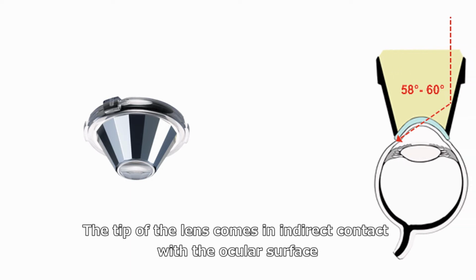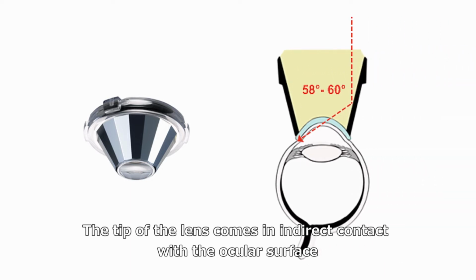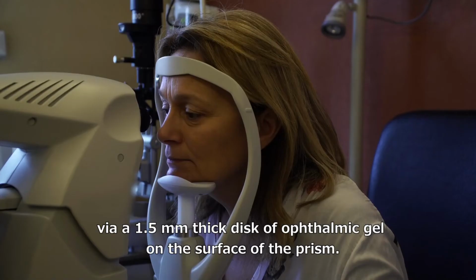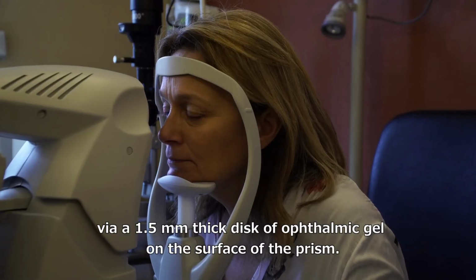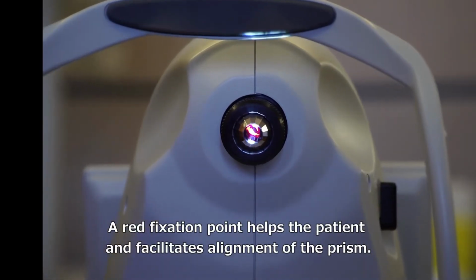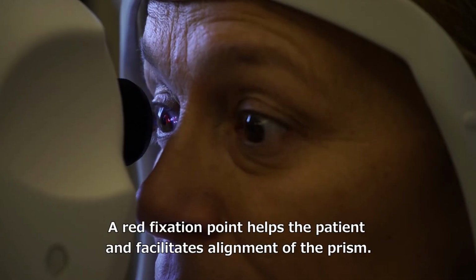The tip of the lens comes in indirect contact with the ocular surface via a 1.5 mm thick disc of ophthalmic gel on the surface of the prism. A red fixation point helps the patient and facilitates alignment of the prism.